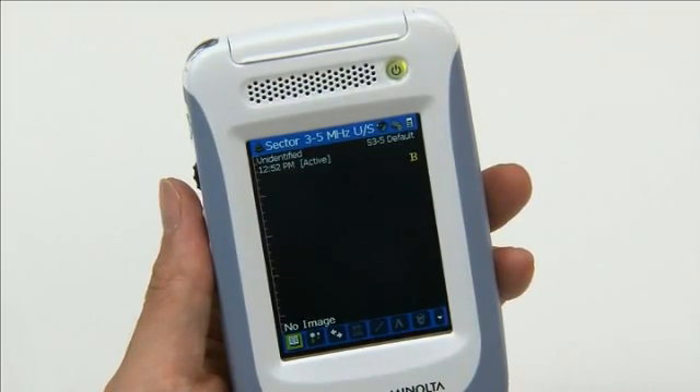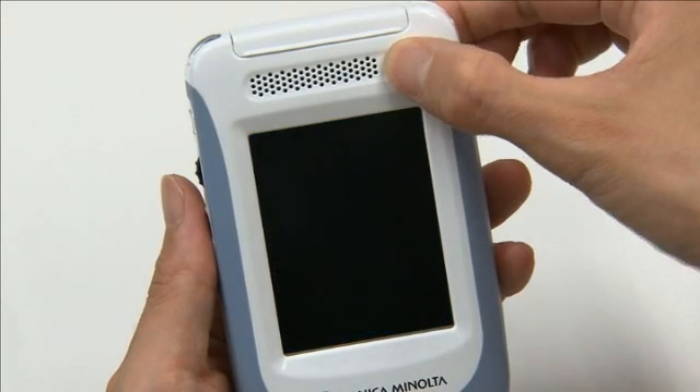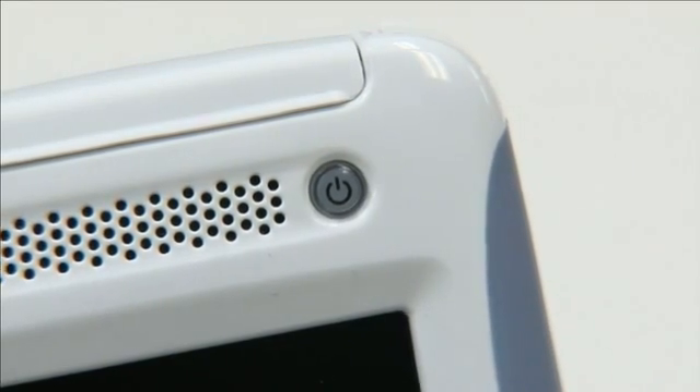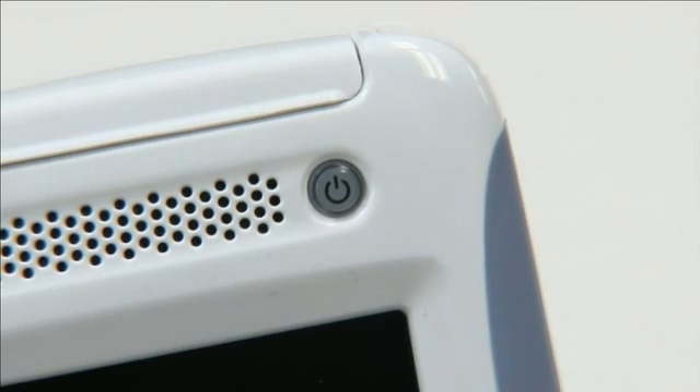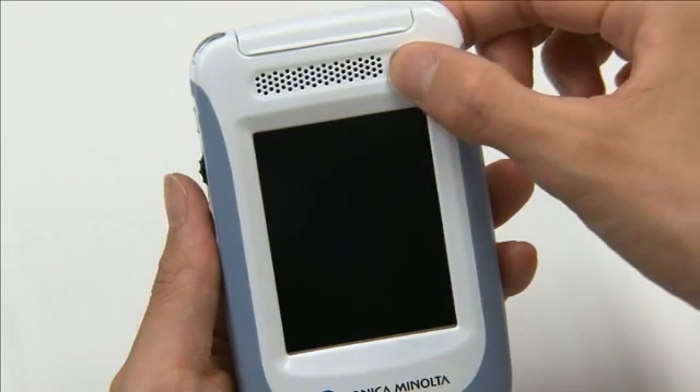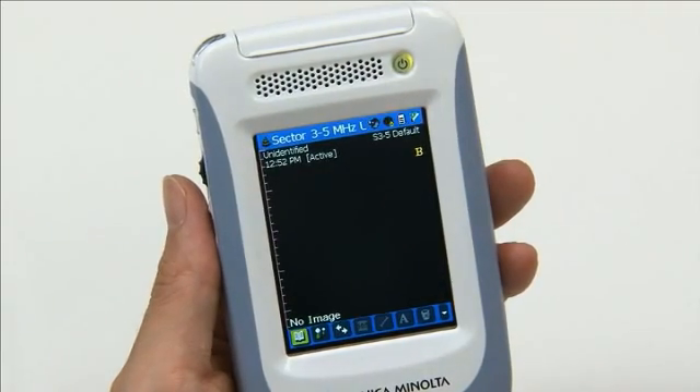To put the SonImage P3 into standby mode, with the power on, press the power button once. When in standby mode, the power button blinks. To resume use, press the power button again. The device can now be used.